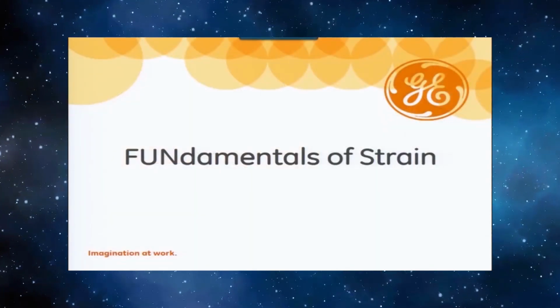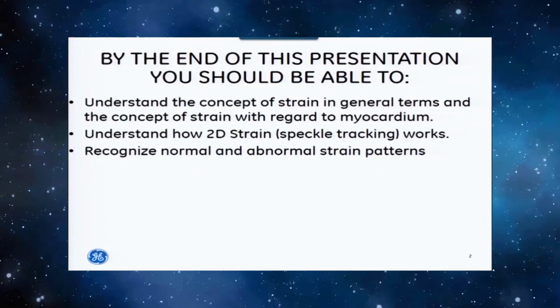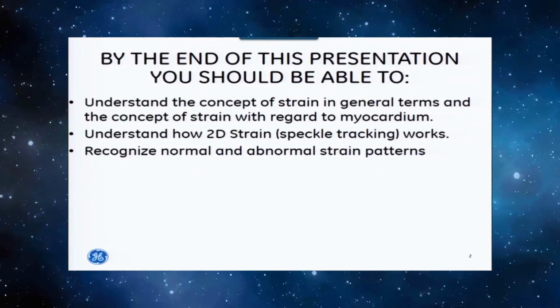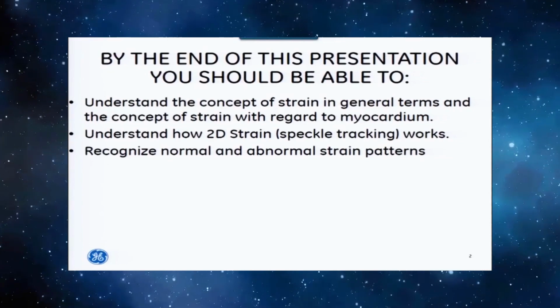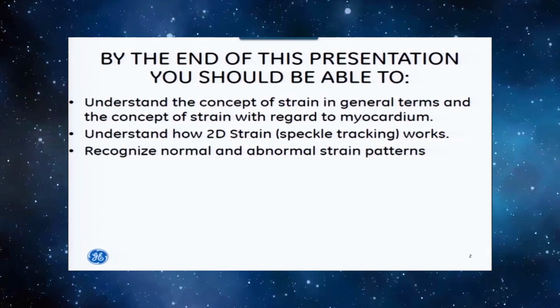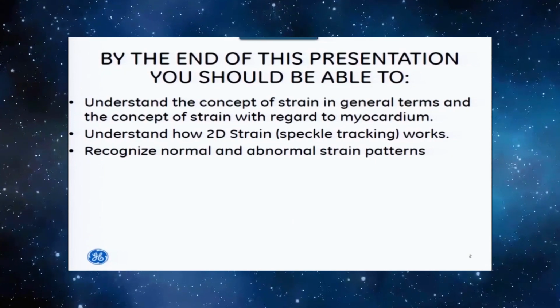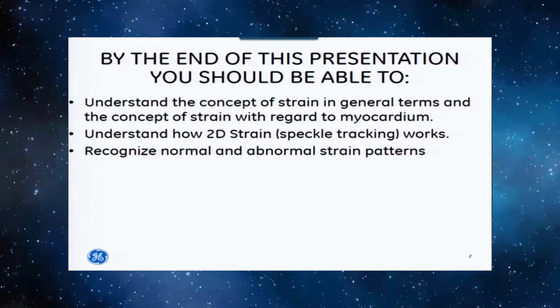All right, so let's get started with the fundamentals of strain. What we're going to do with this presentation is give you a very intuitive and technical understanding of what strain is. And I say intuitive because if you have an intuitive understanding of what strain is, you can apply it to pretty much any situation that you need to.